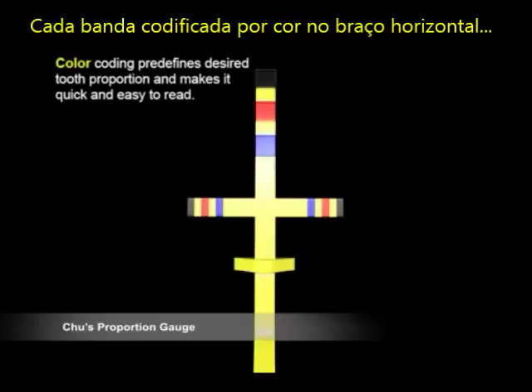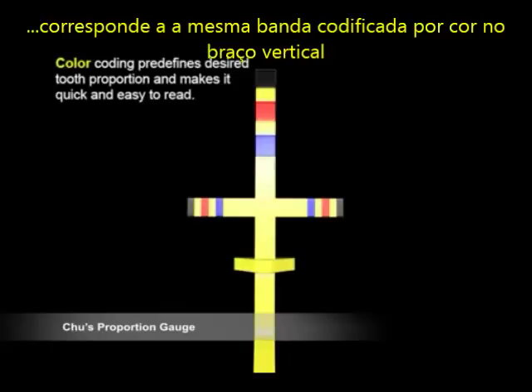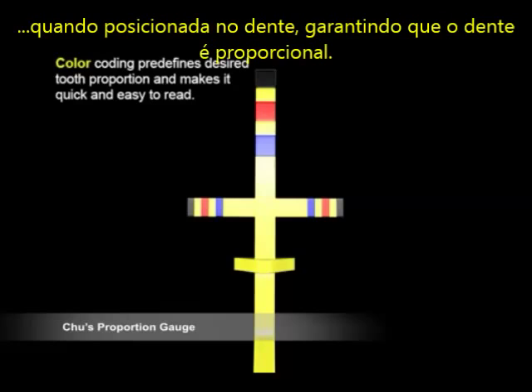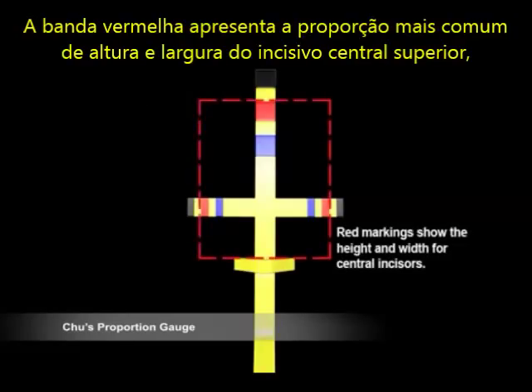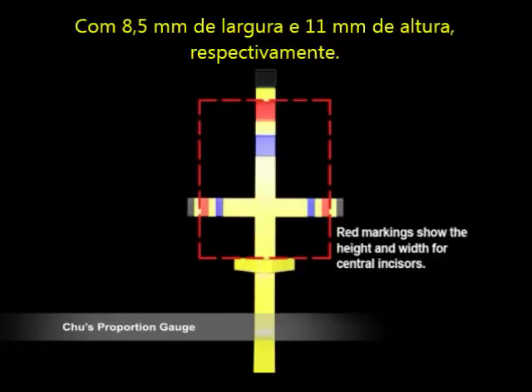Each color-coded band on the horizontal arm corresponds to the same color-coded band on the vertical arm when placed on the tooth, ensuring that the tooth is proportional. The red bands show the most common height and width of the maxillary central incisor at 8.5 millimeters in width and 11 millimeters in length, respectively.